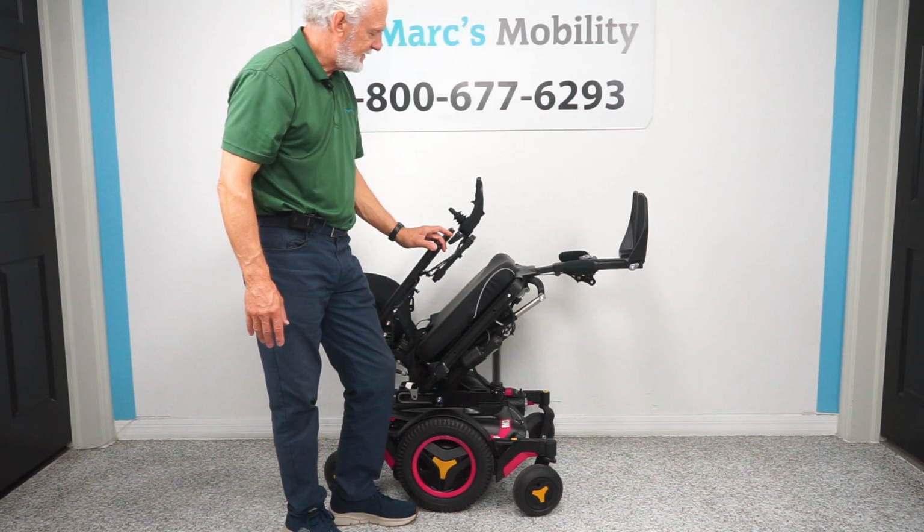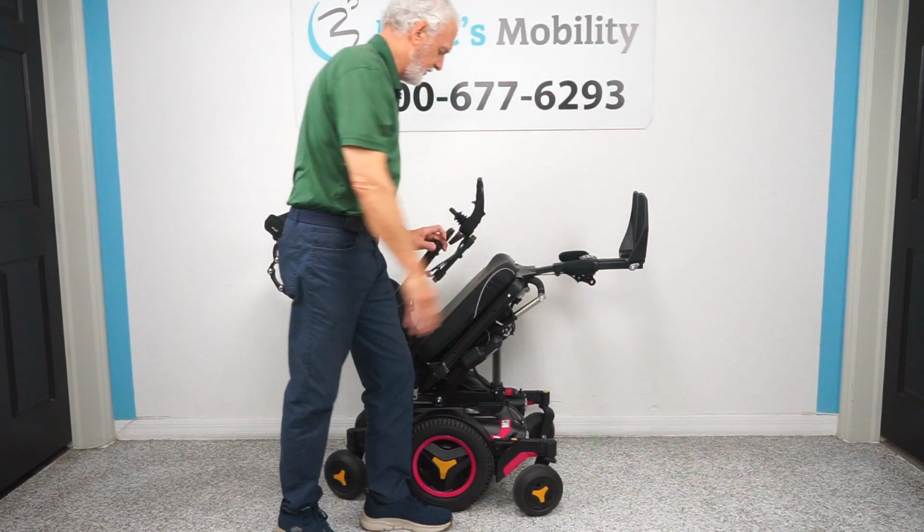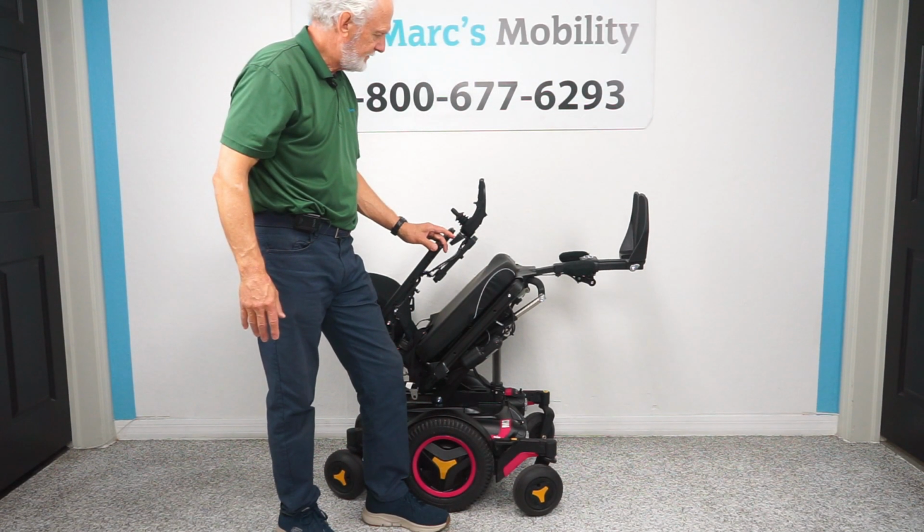And now if you want the feet higher, you need to bring them up before you tilt the seat, then they would be all the way up to here, okay? So let's bring the tilt down.